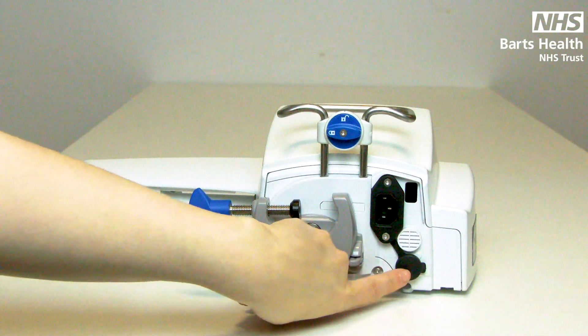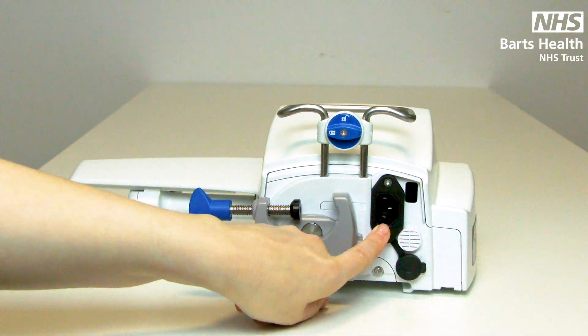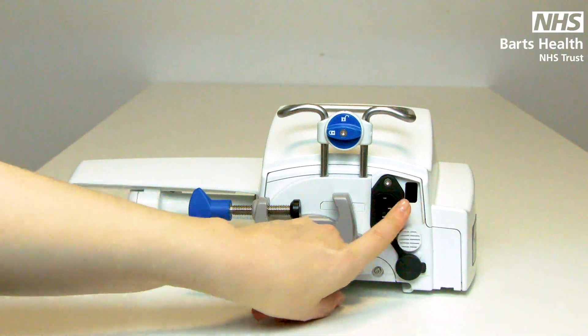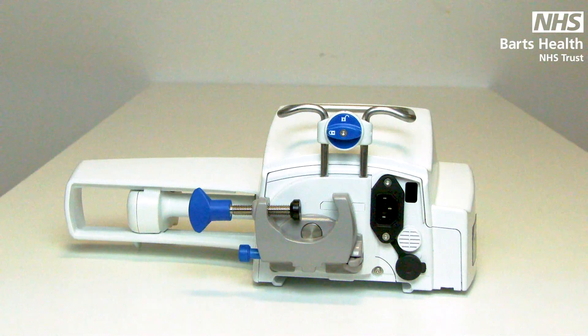You will also find a communication port, speaker, three-pin charging point and infrared sensor. The infrared sensor is used on ITU and HDU units for the link systems.